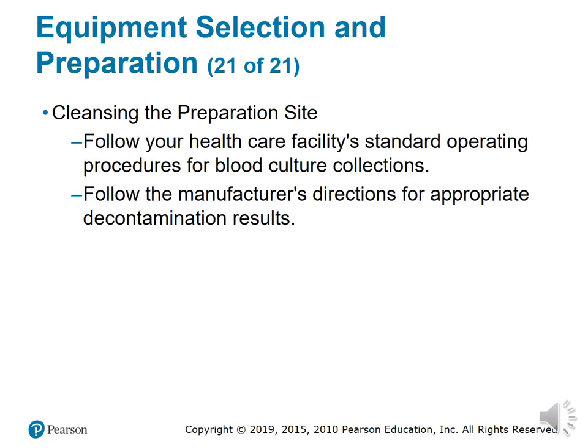Right. Follow your healthcare facility standard operating procedure for blood culture collection. Follow the manufacturer's directions for appropriate decontamination results.